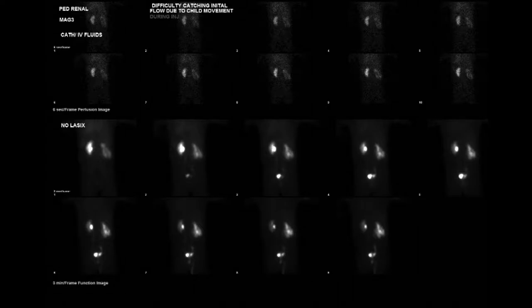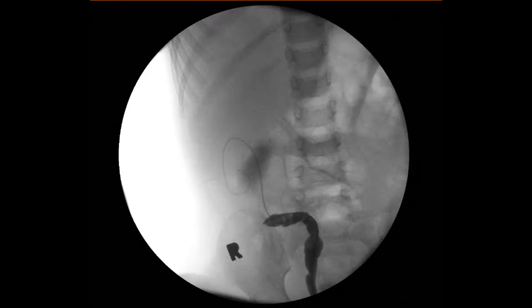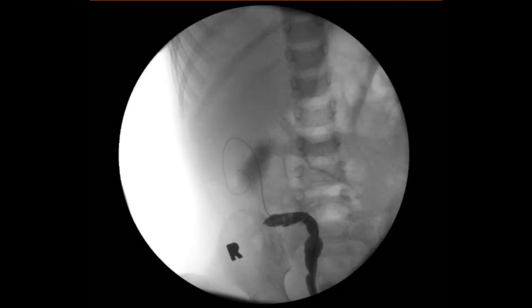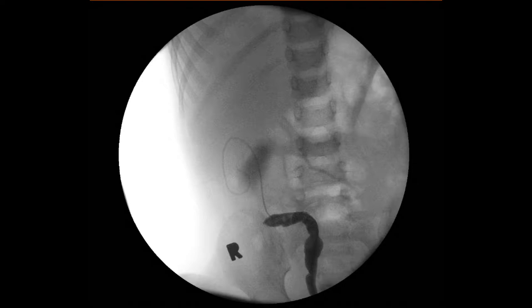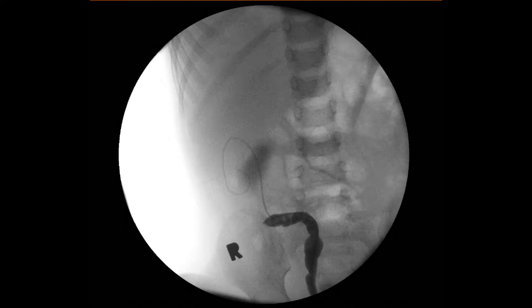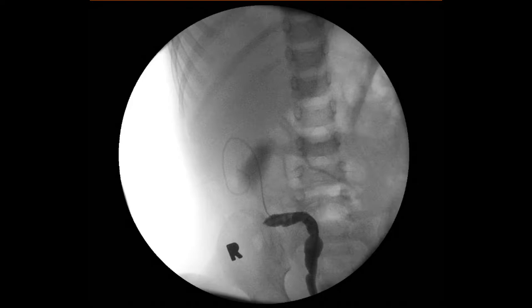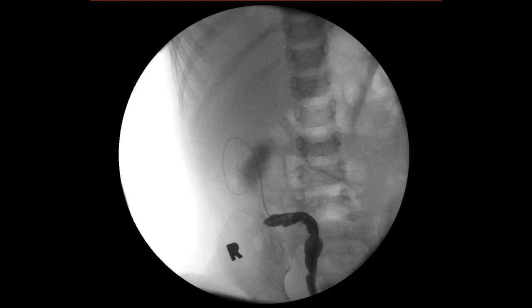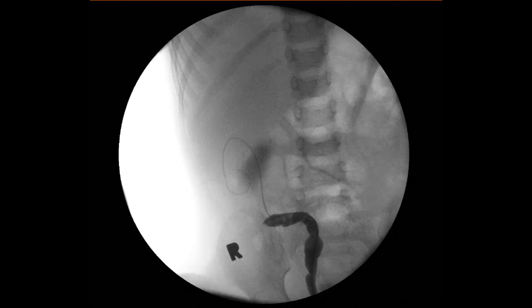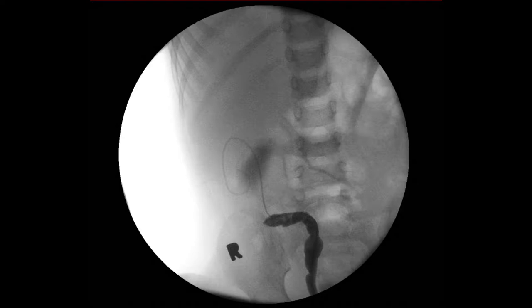This is a MAG3 scan performed with the ureteral stent in place, just showing good function of the right kidney. And finally, this is a right retrograde ureteral pyelogram showing an abrupt end to the contrast progressing from distal to proximal, and then some contrast that made it into the renal pelvis. That was the defect — the distance between the most proximal aspect of that contrast and then the renal pelvis contrast. You can see the wire going all the way into the kidney.